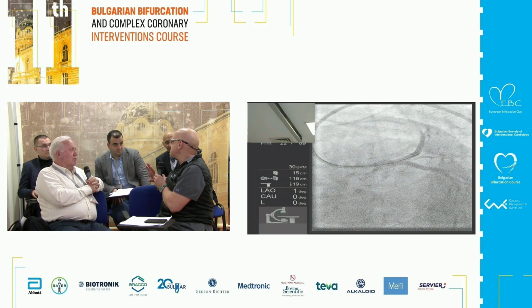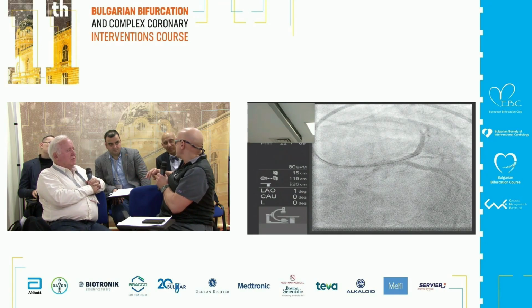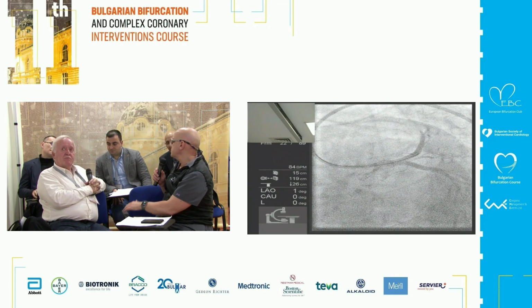The angio was absolutely innocent for a left main. But when you put the IVUS, you see that it is a very significant stenosis at the distal part, across with circular calcium, and we did shockwave and so on, and the result was very good.